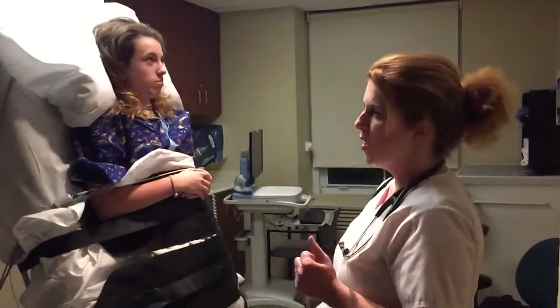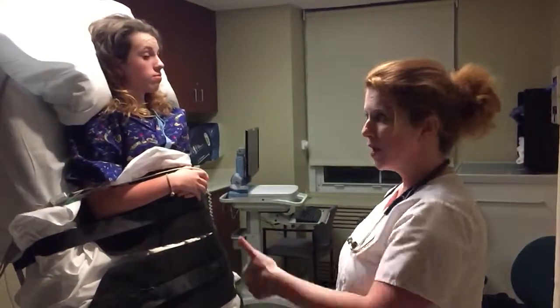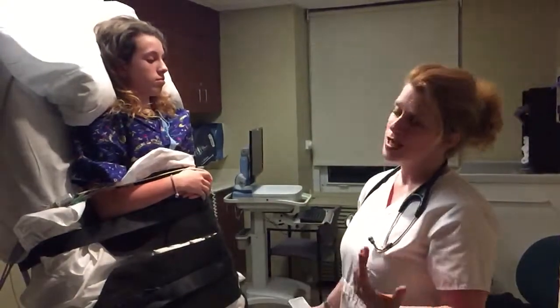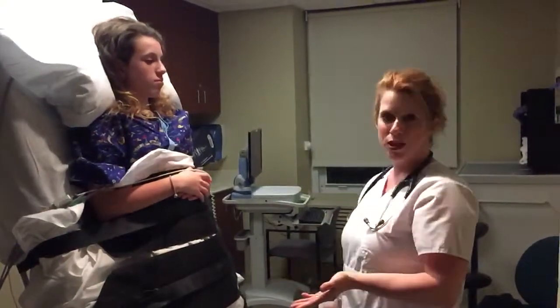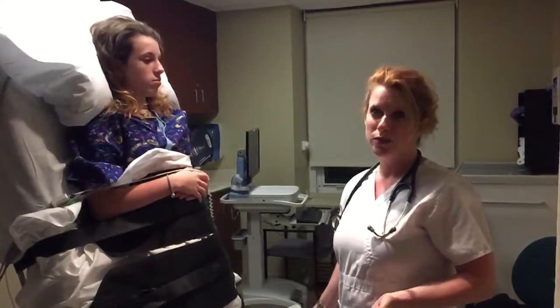Good. If we are going to see a syncopal episode occur, we normally see a trend of the blood pressure going down, and the heart will try to compensate by increasing the heart rate. A syncopal episode can occur anytime: in the beginning such as now, anytime during, towards the end, or sometimes not at all.